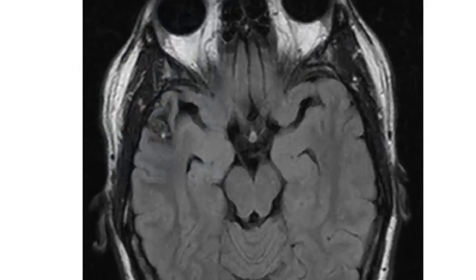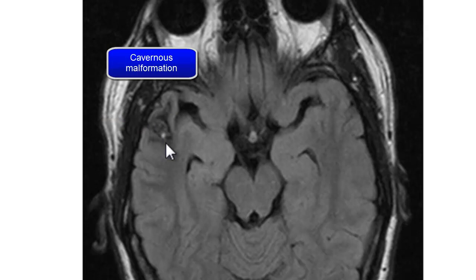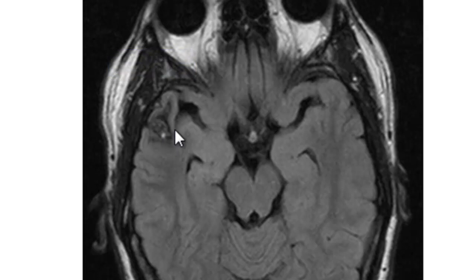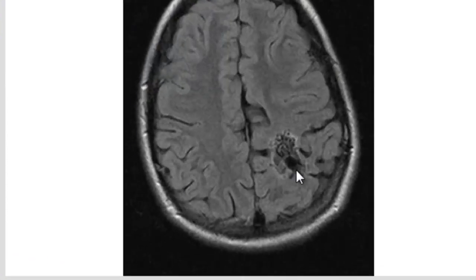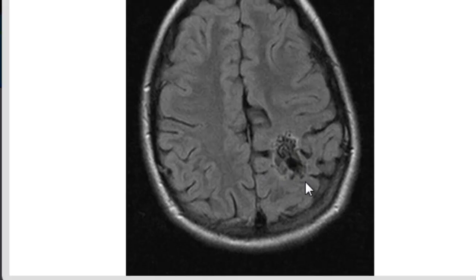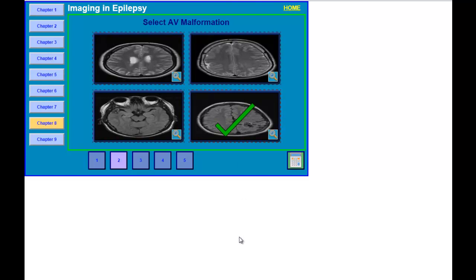What about here? This is an axial section showing the right temporal lobe and the left temporal lobe. Looking at the lateral structure, there is a lesion that is very superficial — a right anterior temporal lesion. This is a cavernous malformation, which has a high association with different types of seizures depending on its location. And then the last image shows a lot of flow voids in the left parietal region — this is an AV malformation. AV malformations can be associated with epileptic seizures, and this is the correct answer.